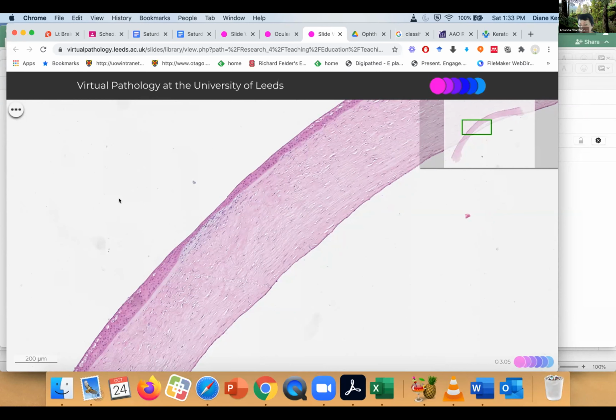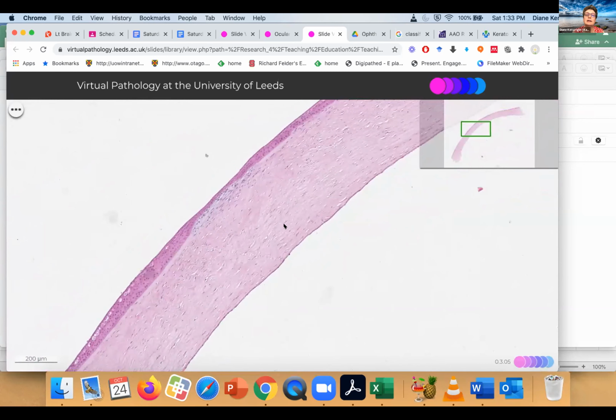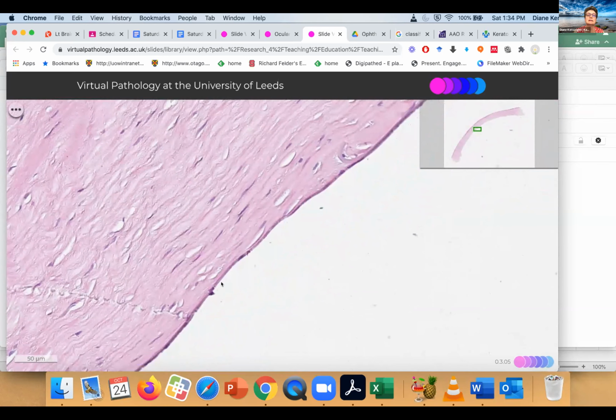And we've got some good questions. Chris has asked about a Descemet's flap. There's a little curl that I can see in Descemet's just in that field. Oh, yeah, in here, there's a curl in Descemet's. I didn't spot that actually. But yes, there we go. We've got a Descemet's break, that would be entirely consistent with keratoconus, wouldn't it?